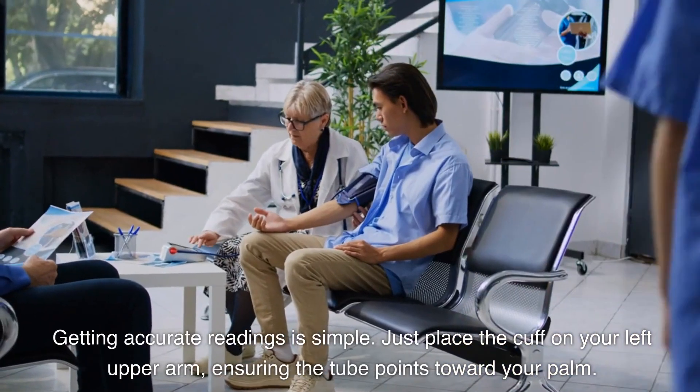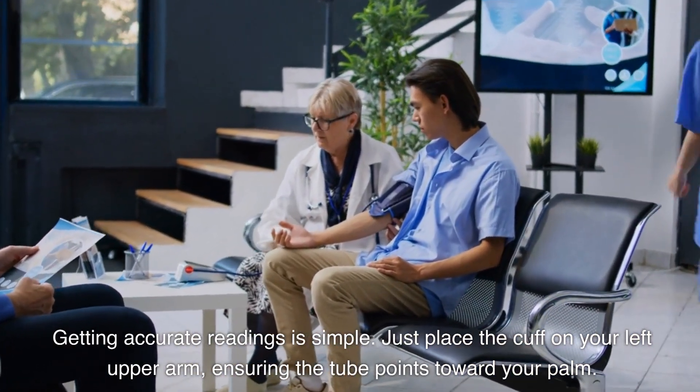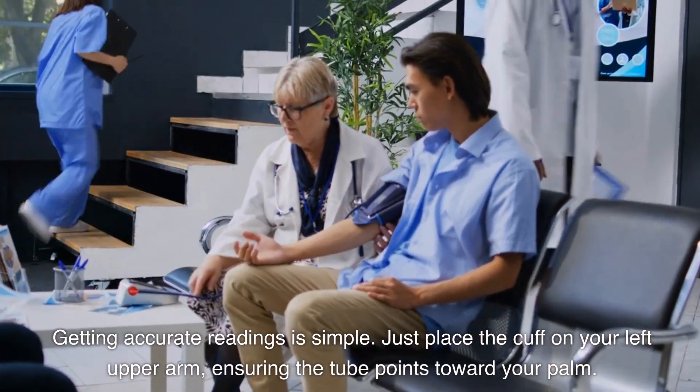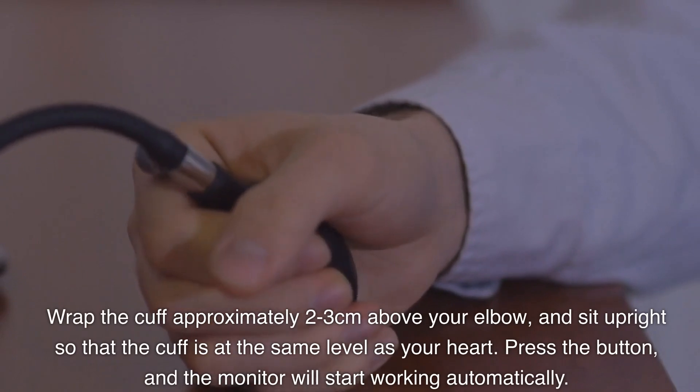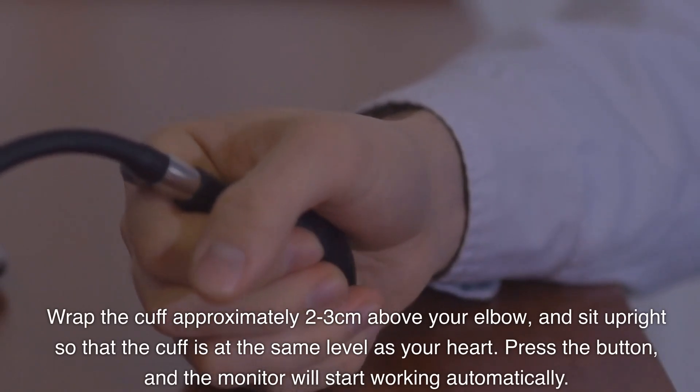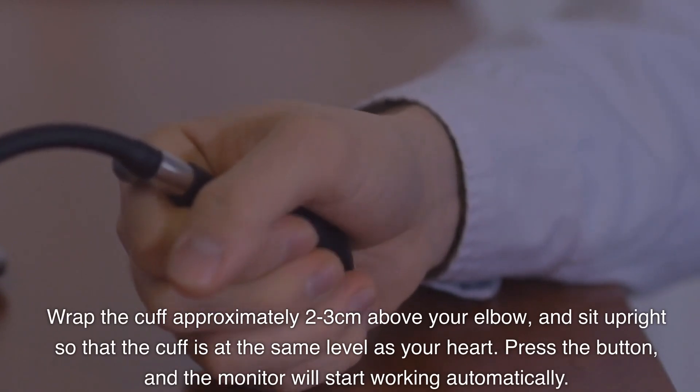Getting accurate readings is simple. Just place the cuff on your left upper arm, ensuring the tube points toward your palm. Wrap the cuff approximately 2–3cm above your elbow, and sit upright so that the cuff is at the same level as your heart. Press the button, and the monitor will start working automatically.